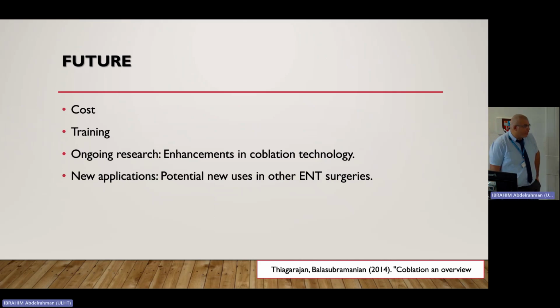I think the future challenge is the cost, but it is possible. It needs a little bit of training. If you look online, there are not a lot of studies about it. Everything is focused on tonsillectomy only, whether it's tonsillotomy, just medial to the capsule, or lateral, which is the extracapsular type. I think this is a limitation, and the size. Sometimes I feel it's very difficult to get the handle through the nose.